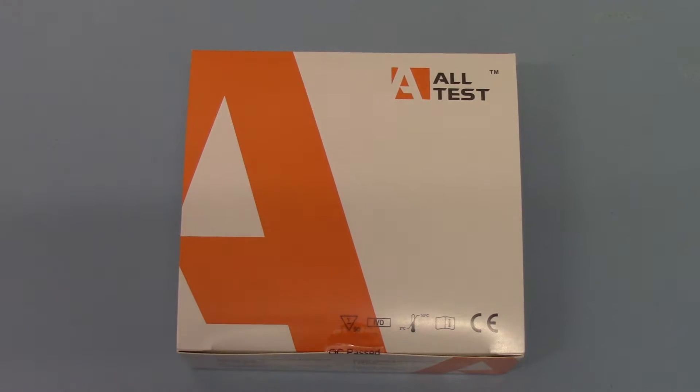Welcome to this product demonstration video for the new Alltest Ultra Cannabis Urine Test Strip. This has been introduced into the UK markets in late 2016. We're bringing it in regularly now, it's proving very popular and we're just going to run you through the test formats and the packs available.